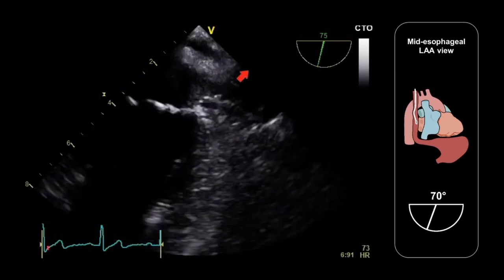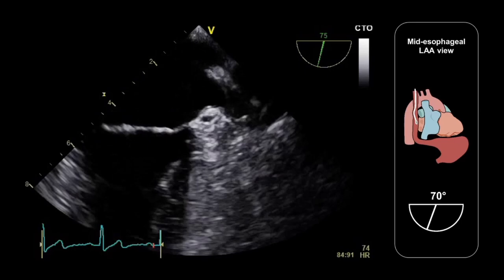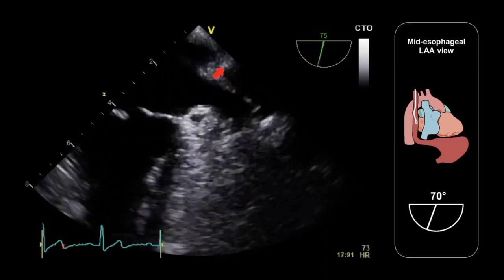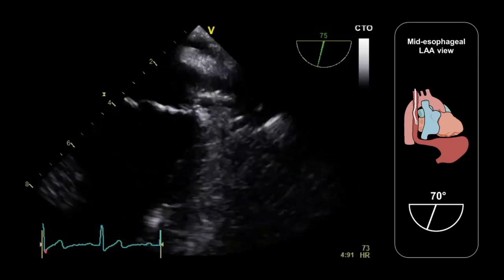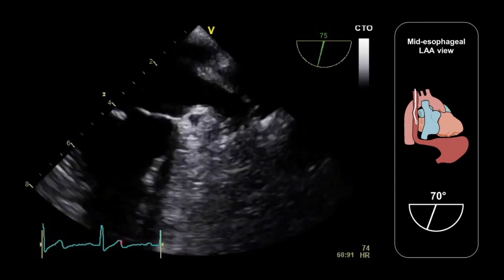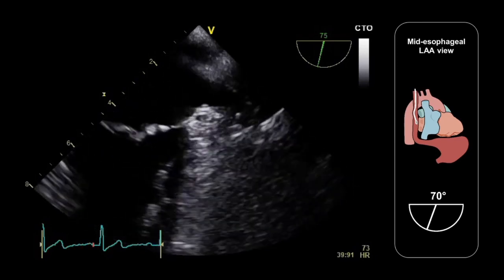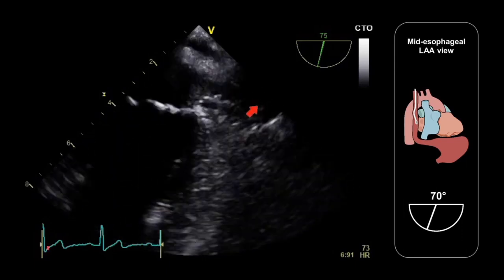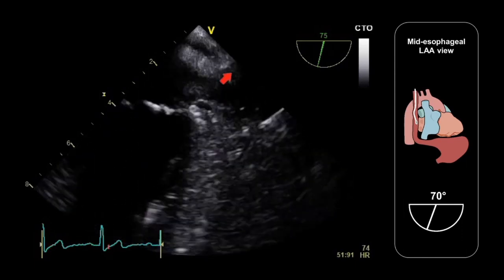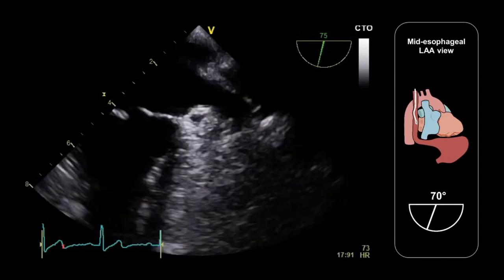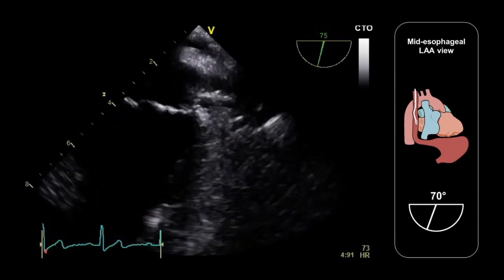Adjacent to the appendage we have the left upper pulmonary vein, and in between the two we have the postero-lateral ridge, which is sometimes known as the ligament or fold of Marshall. It's also been known as the warfarin ridge, because some people have mistaken this structure for thrombus and incorrectly recommended anticoagulation with warfarin.